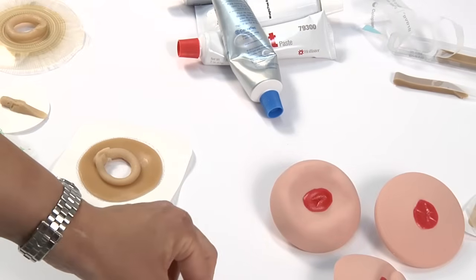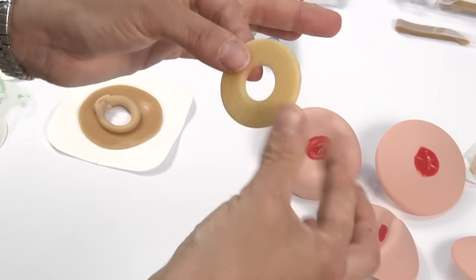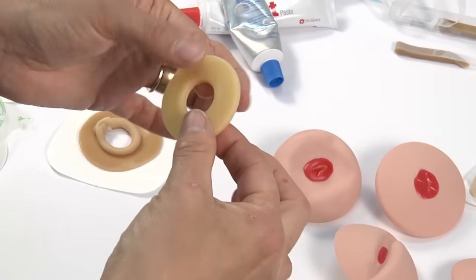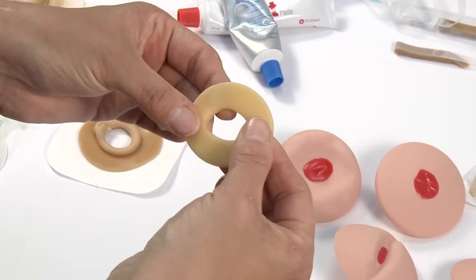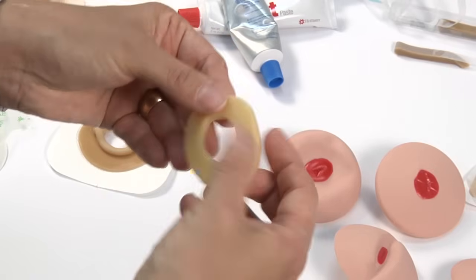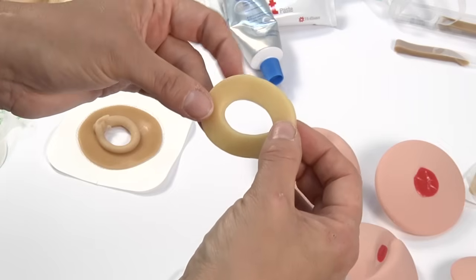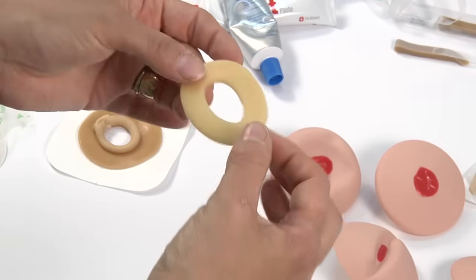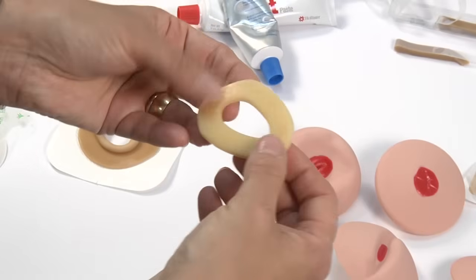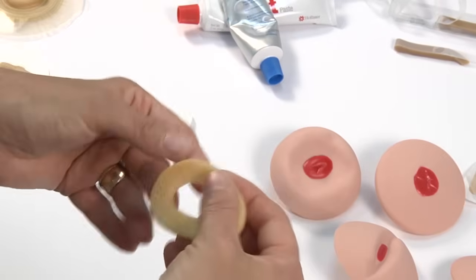So again, there is a lot of flexibility associated with the utilization of these rings. There's tack on both sides, so there's no right or wrong to it. And these have no memory to them, so when you stretch it out into the shape and size that you want, it will actually stay there. It's not going to want to pull back into the original shape that it started out with. One thing you do have to take note of is the more you stretch, the thinner you make it. Okay, so you have to think about what it is that you want to utilize it for.